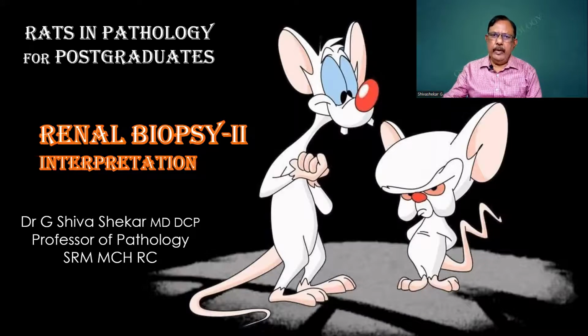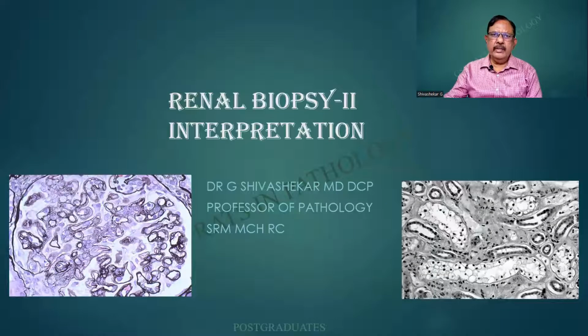Today's class shall be on the interpretation of renal biopsies. There are a plethora of pictures that are going to stare at us. I hope you will be able to unveil the mysteries that they have in them.